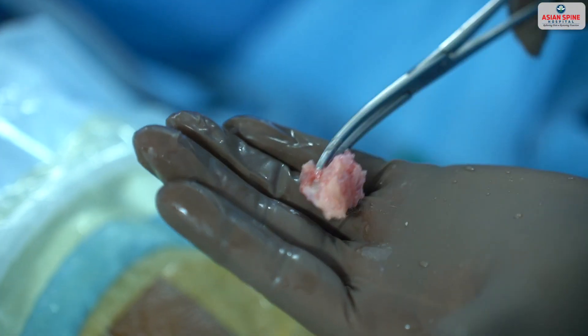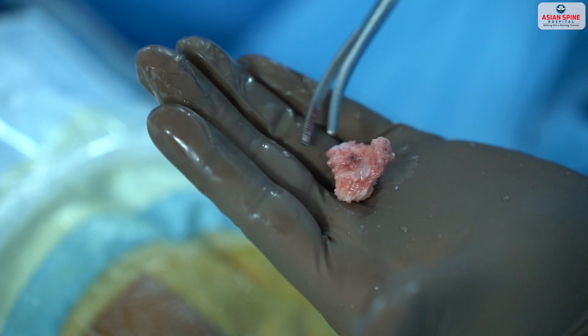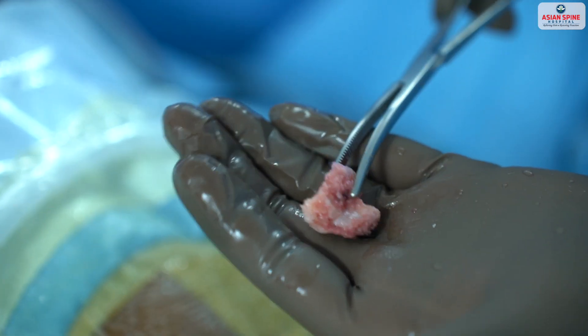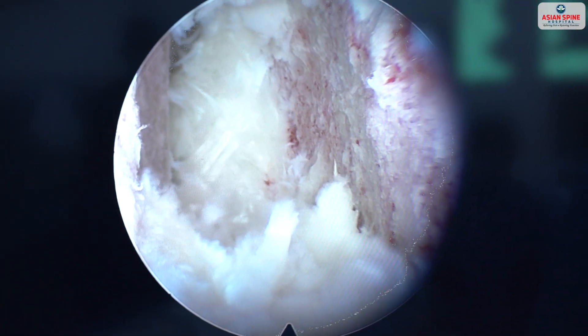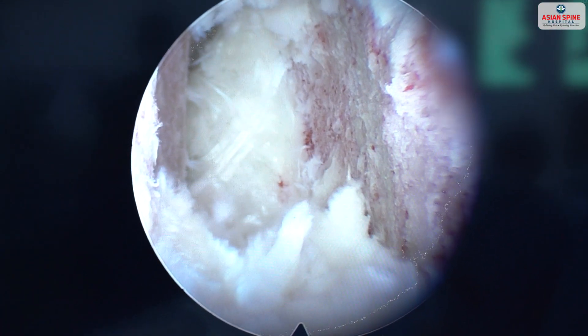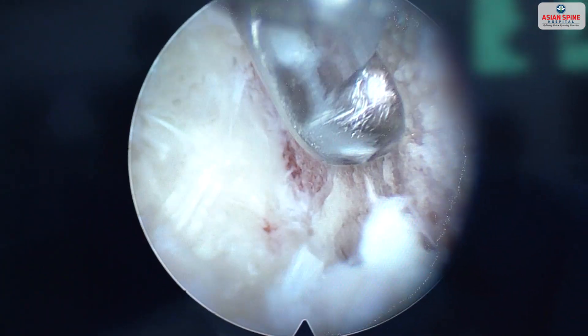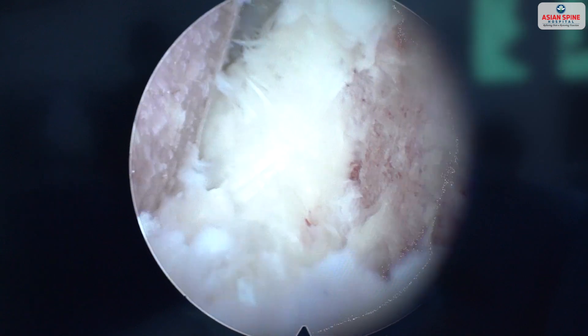The patient's own graft is removed through that small incision of 10 mm. Once the graft is removed, we prepare the end plate and decompress the nerve. You can see the entire disc has been removed and the end plates are prepared as anteriorly as possible.